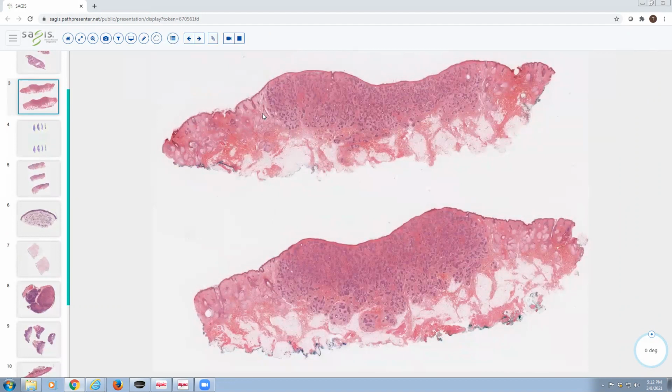Okay, our next case is kind of a foil to the two previous diagnoses of basal cell carcinoma. And now we're going to talk a little bit about some of the benign adnexal neoplasms that are follicular in origin. And so I kind of think of these and describe them with residents as the trichos. So tricho is a prefix for several different benign neoplasms that you'll encounter in dermatopathology.